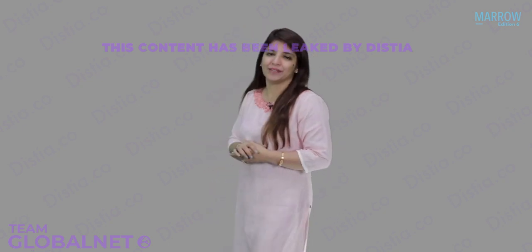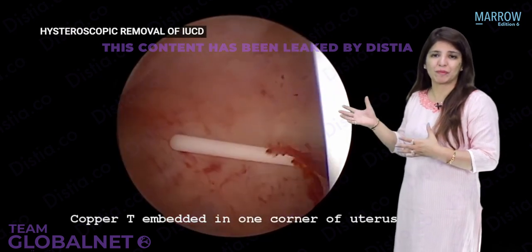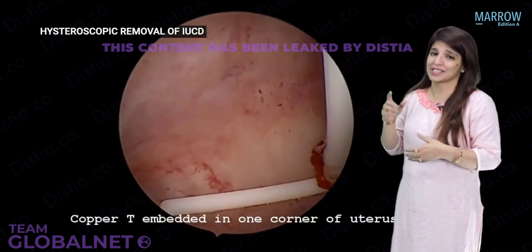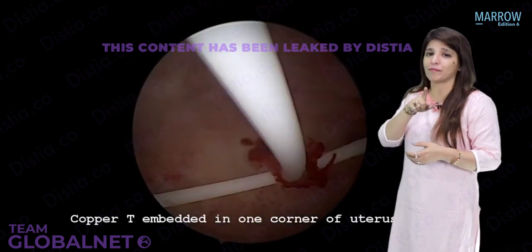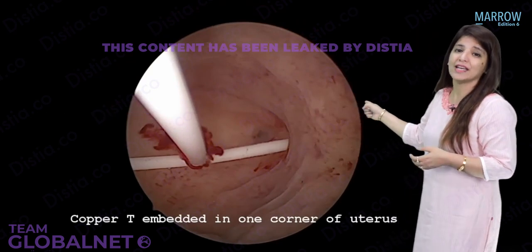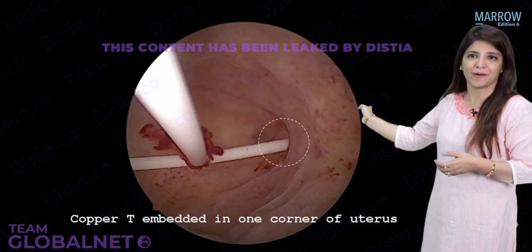So look over here. This is the hysteroscopy being performed, and I'm sure by now you all know how a hysteroscopic image of the uterus looks inside. And as you can see, the copper T. On one side, the copper T is placed properly. The ostia is open. But on the other side, now look over here. Can you see that the arm of the copper T is going inside the ostia? Yes.